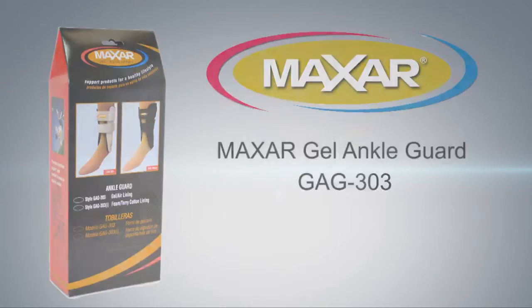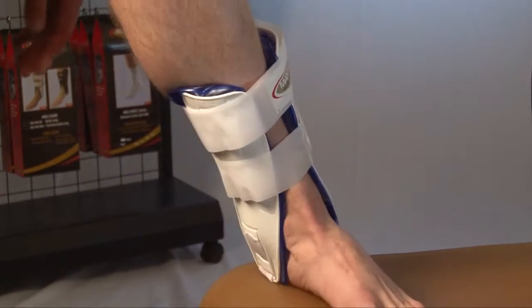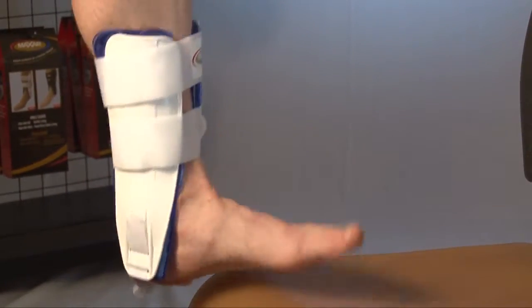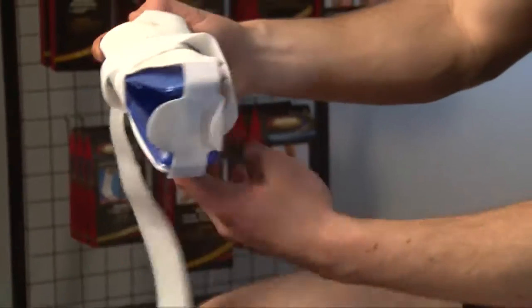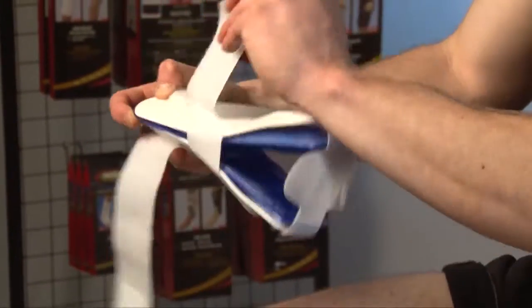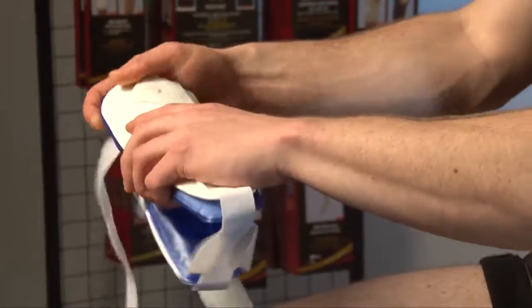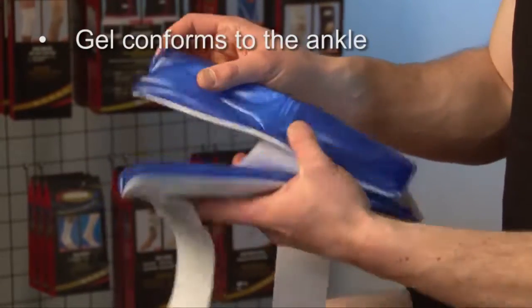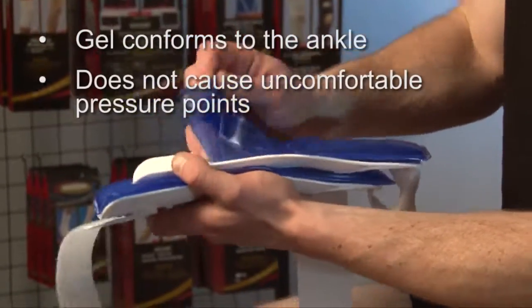The Maxar Gel Ankle Guard is designed with anatomically designed rigid outer shells to provide ankle immobilization. There are two strategically placed diagonal straps with Velcro that create a more precise fit. The gel conforms to the ankle and does not cause uncomfortable pressure points.